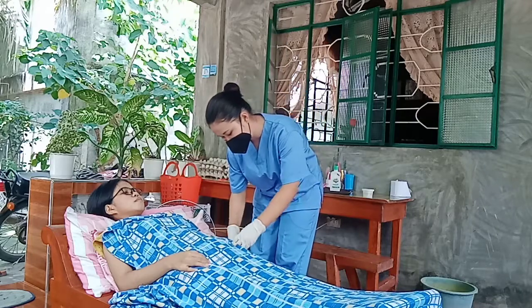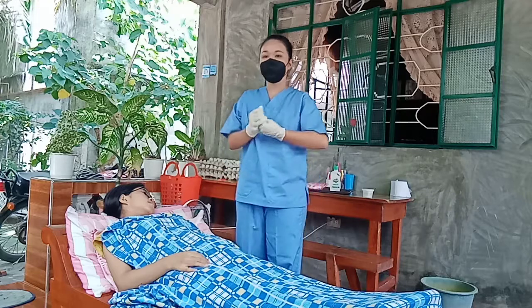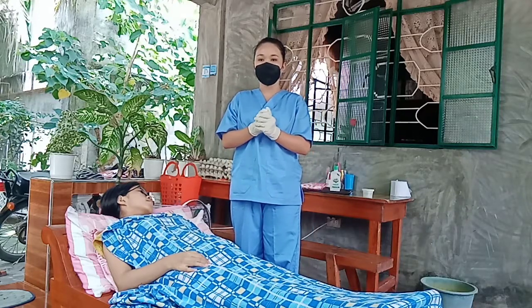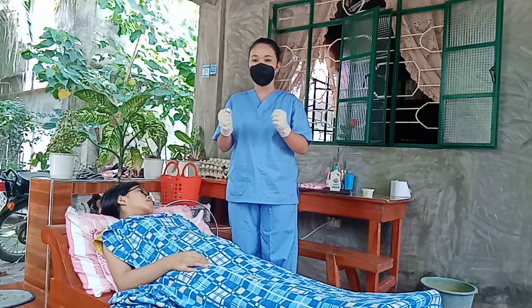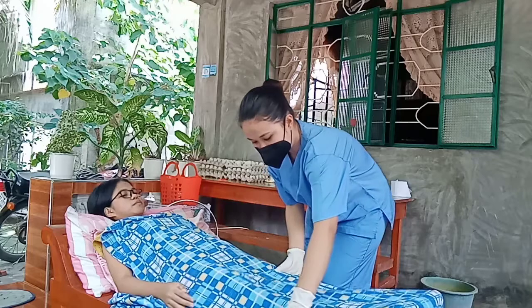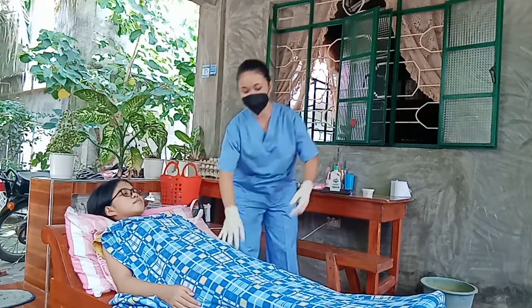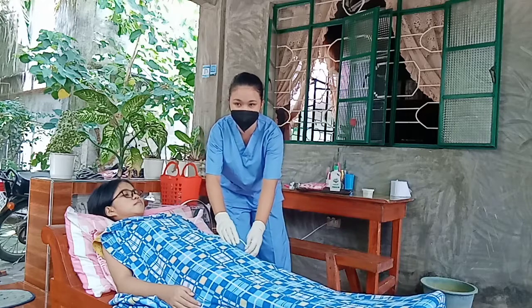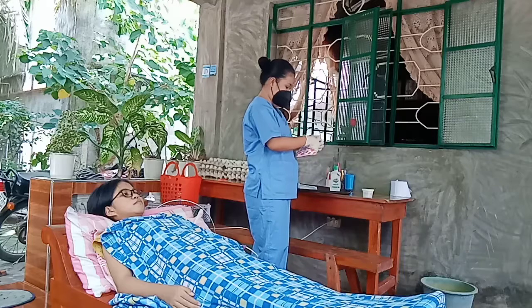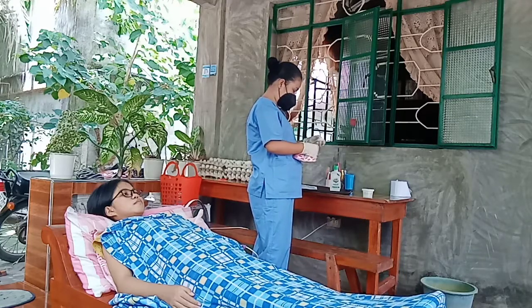So, this is the site where we will clamp. Then next is position the patient properly, then locate the port, then clean port with disinfectant and allow it to dry. So, position the patient. Can you move, ma'am? Then locate the port, then clean the port with disinfectant and allow it to dry. So, I will use cotton ball with alcohol to clean the port.